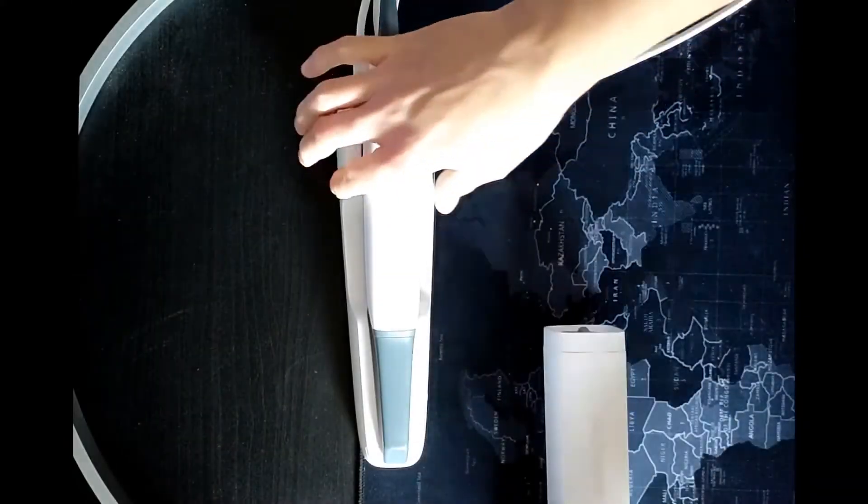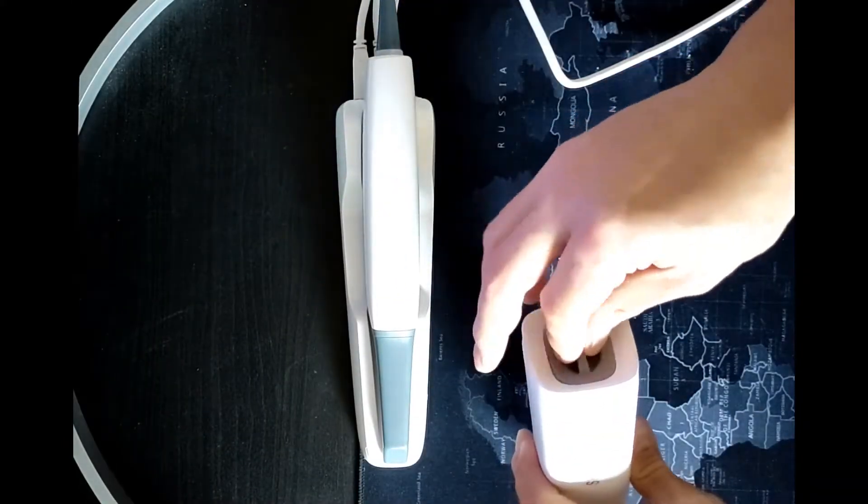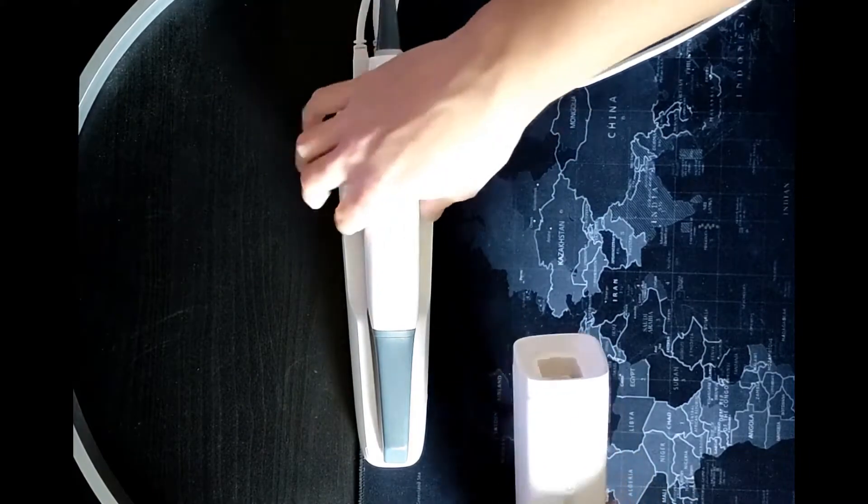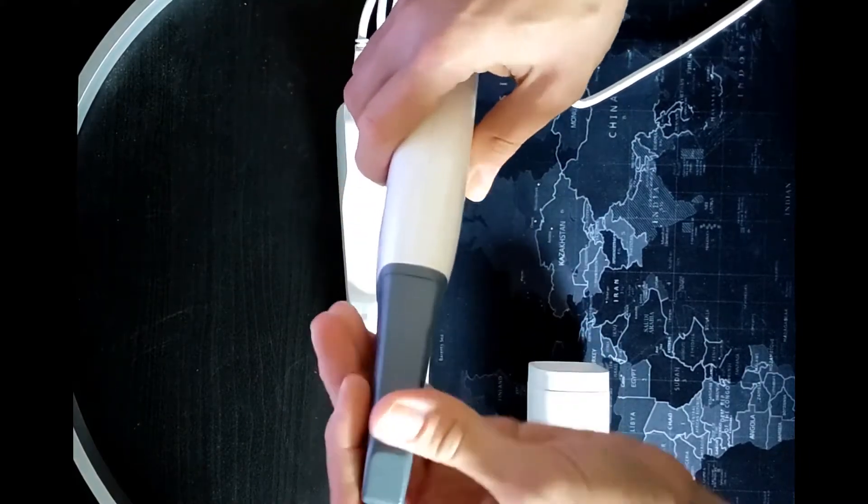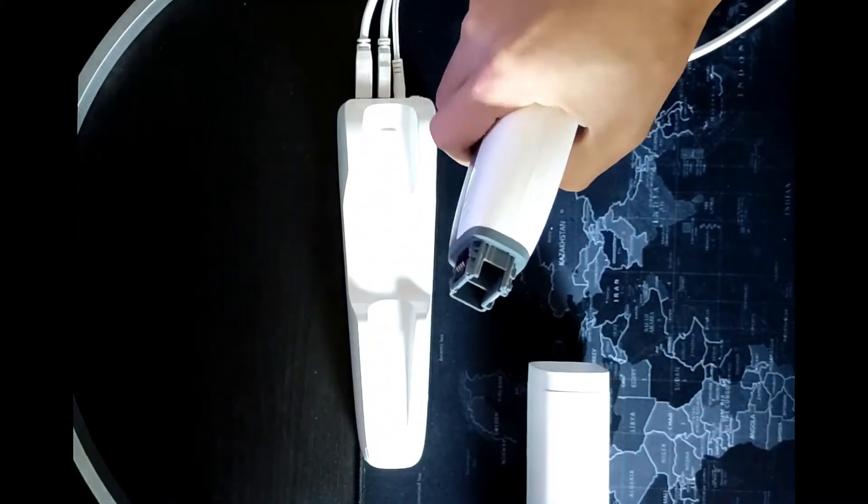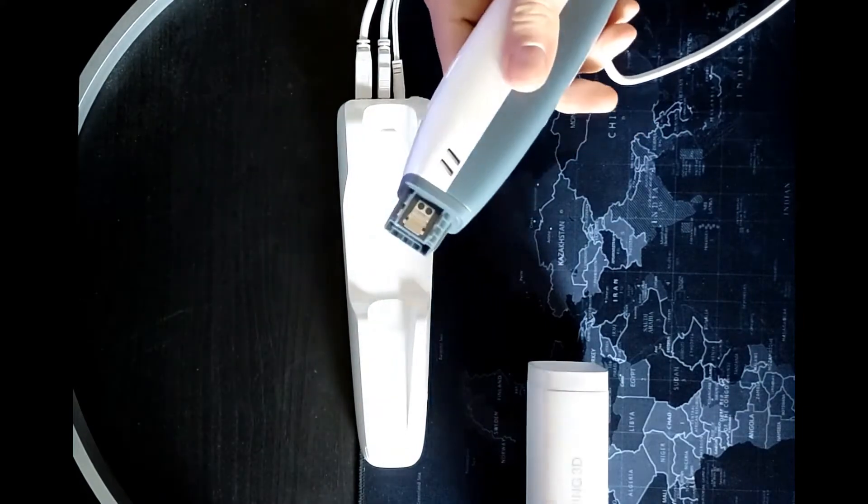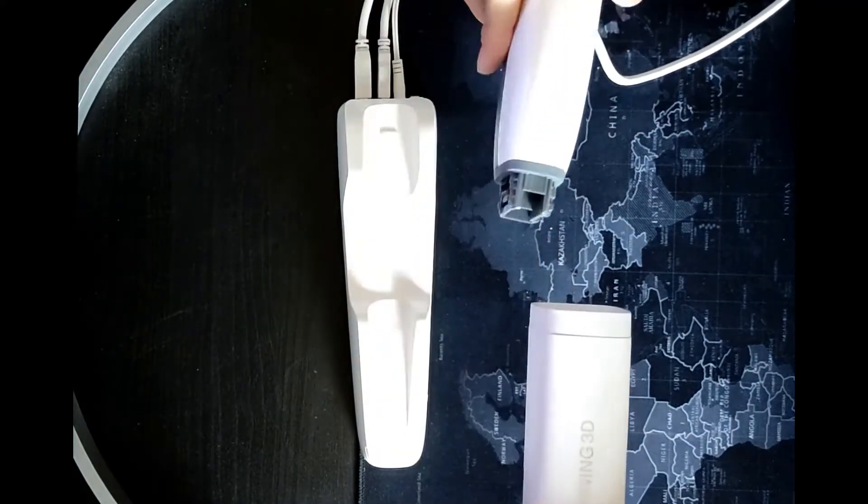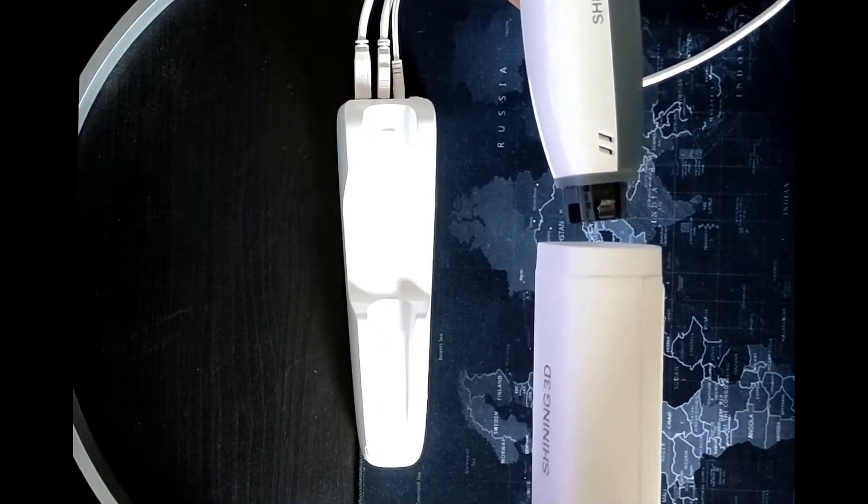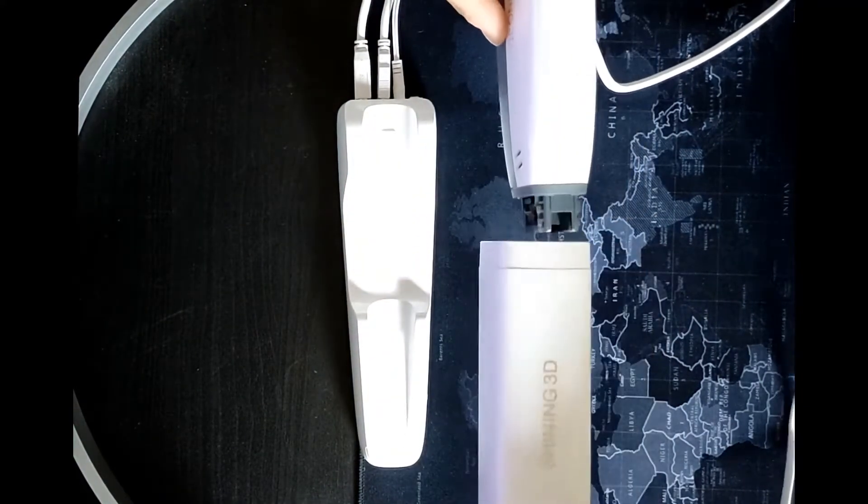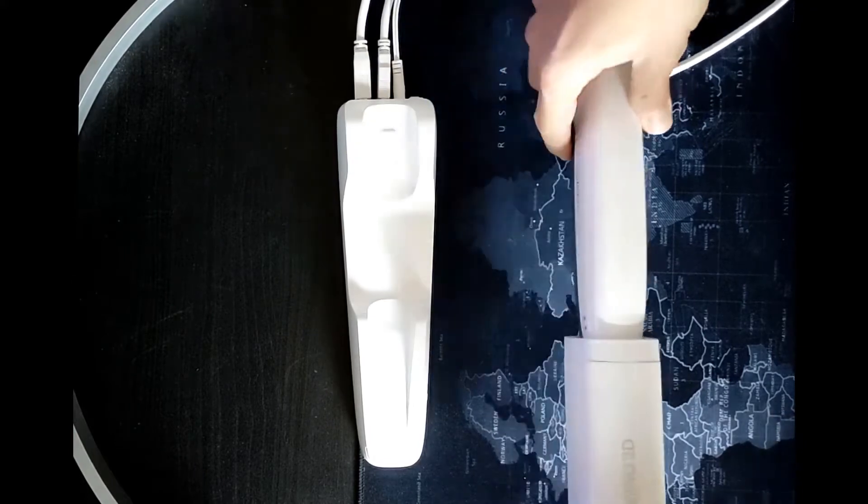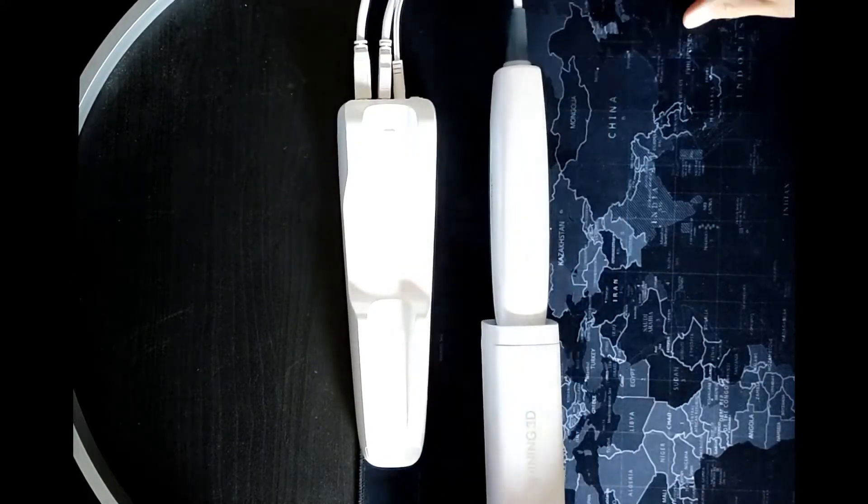Proceeding with the calibration process, it's necessary to remove the protection cap, then remove the scanner tip and connect the scanner directly into the calibration tool.